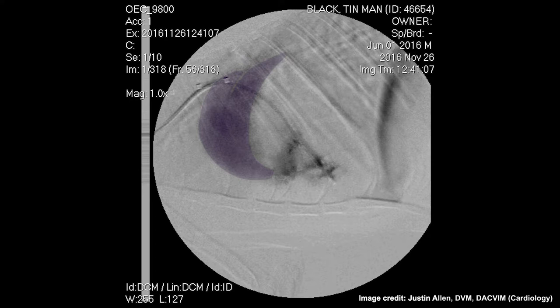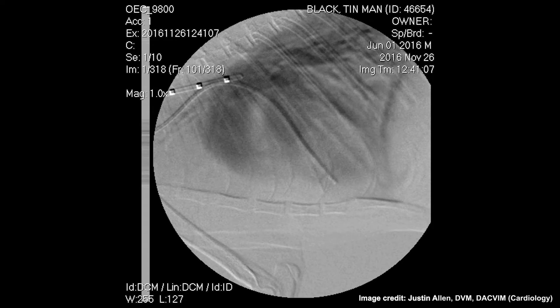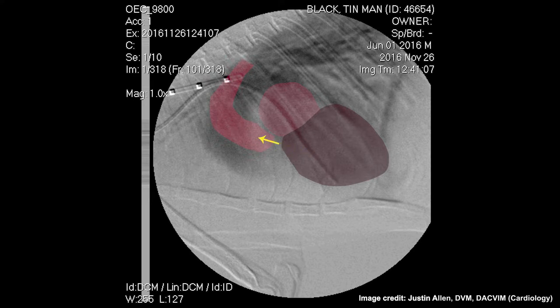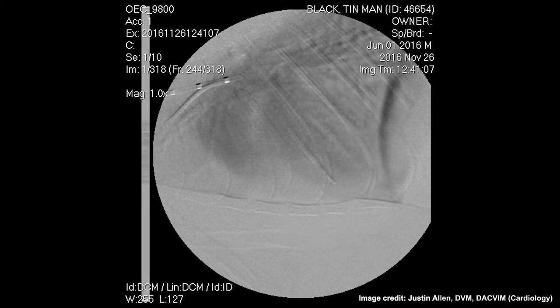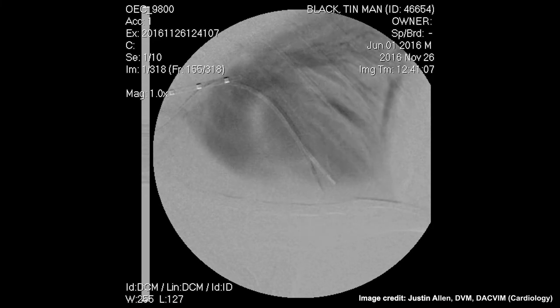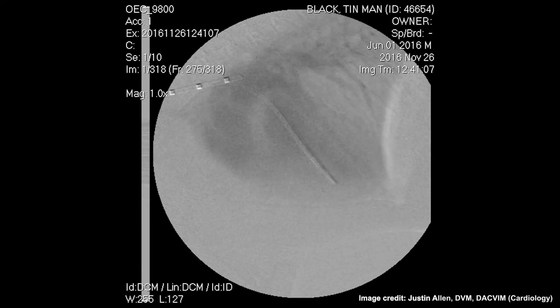Contrast can still be visualized inside of the right ventricle. Now we see the contrast returning from the lungs through the pulmonary veins back to the left atrium and left ventricle. We can see the delimitation of the aorta where part of the contrast is being pumped to. However, a large part of the contrast is also shunted back to the right ventricle through a ventricular septal defect and ends up again inside of the pulmonary trunk. As the contrast continues to circulate between the heart and the lungs, it gets diluted out with new blood entering the right atrium, so the black contrast fades away.